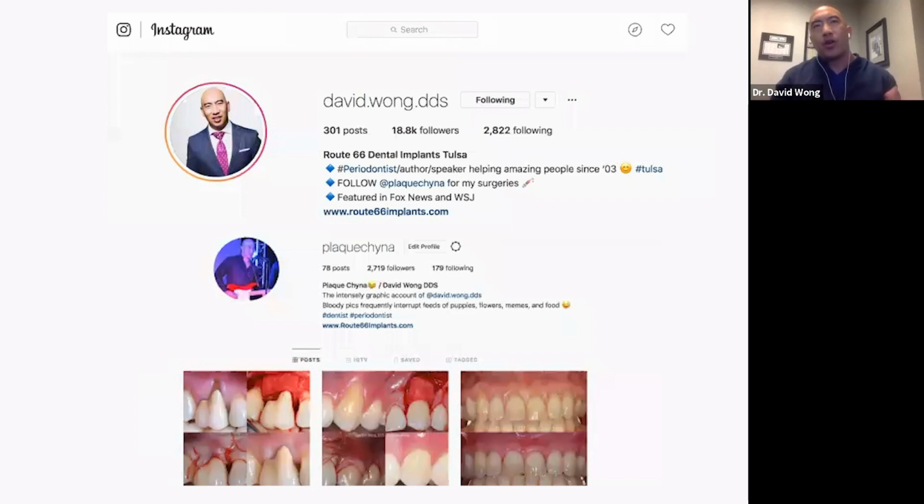Most of them are focused on the implant integrating rapidly. They're not so much focused on preventing disease breakdown. So nowadays it's not an issue, but in the old days you wanted to avoid the hydroxyapatite or the HA coating. Nowadays you don't have to worry about that.